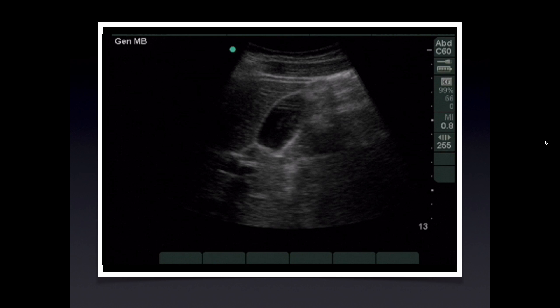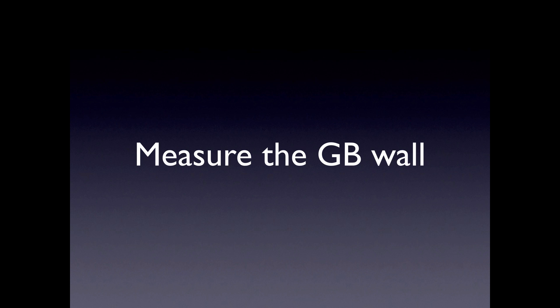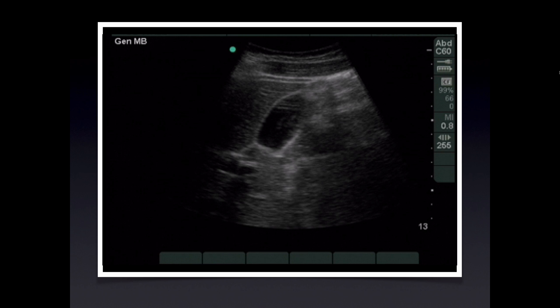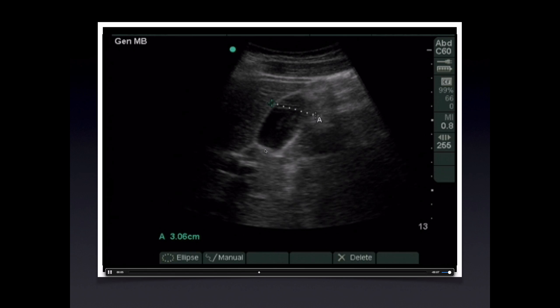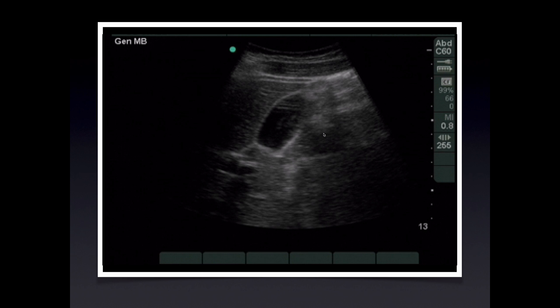After looking for abnormalities within and around the gallbladder, we measure the gallbladder wall diameter. Freeze an image at a representative mid-portion of the gallbladder, then hit calipers and measure across the anterior gallbladder wall. Posterior measurements are not reliable because the gallbladder wall appears thicker than it actually is due to posterior acoustic enhancement. The measurement is also not reliable adjacent to the bowel gas due to scatter artifact obscuring the border of the gallbladder wall.